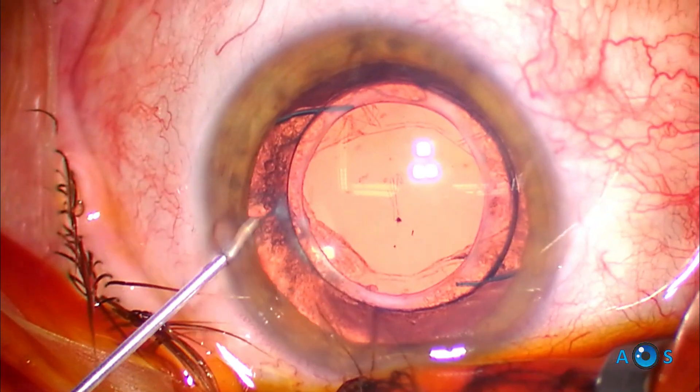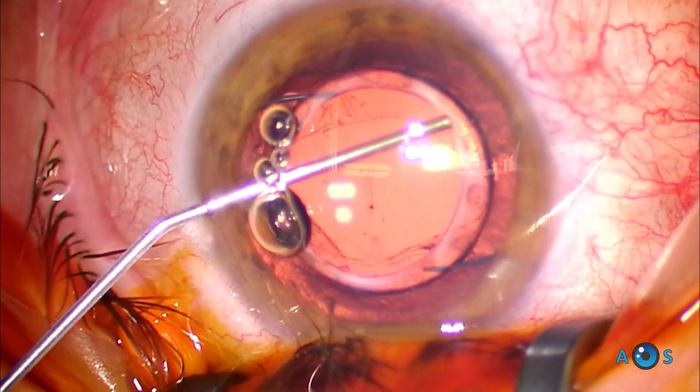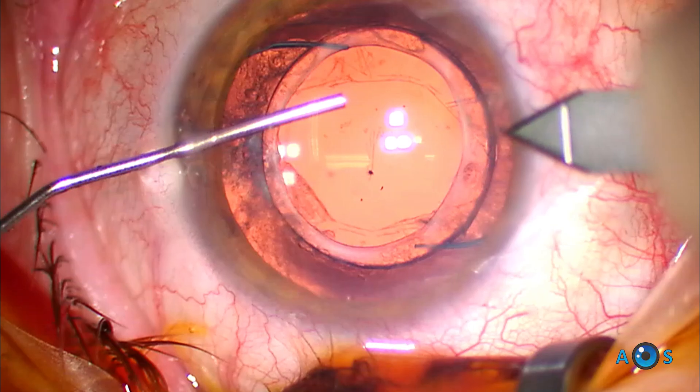The lens features a central 1.5 mm optical zone providing a plus 10.0 diopter addition, resulting in approximately 2.2 times magnification.